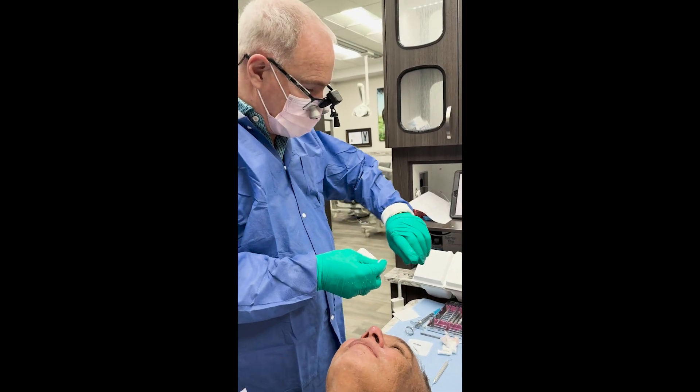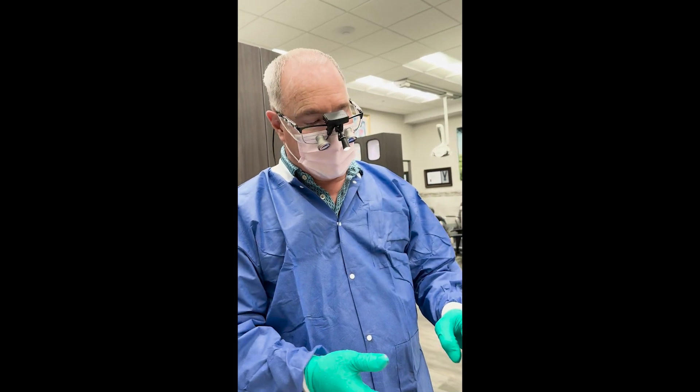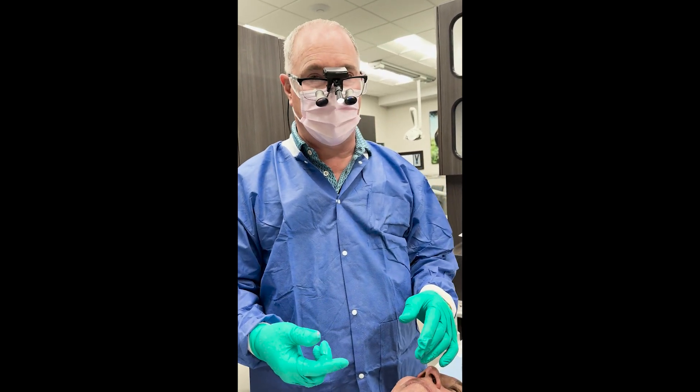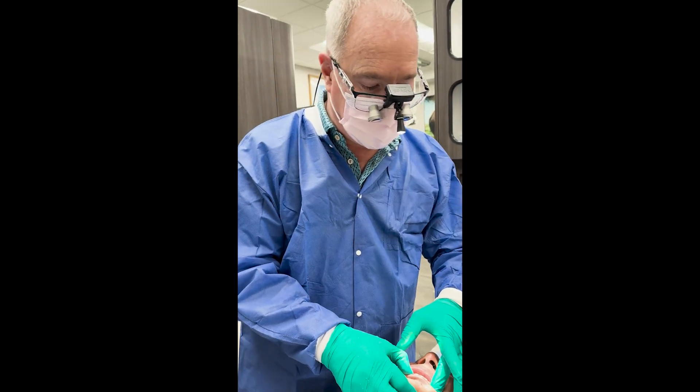In about 15 minutes, we successfully placed 10 mini implants and relined his existing denture as a temporary. Now we're going to take our impressions when we remove this for his permanent teeth, and I'll show you how we do that and how we get a nice bite.